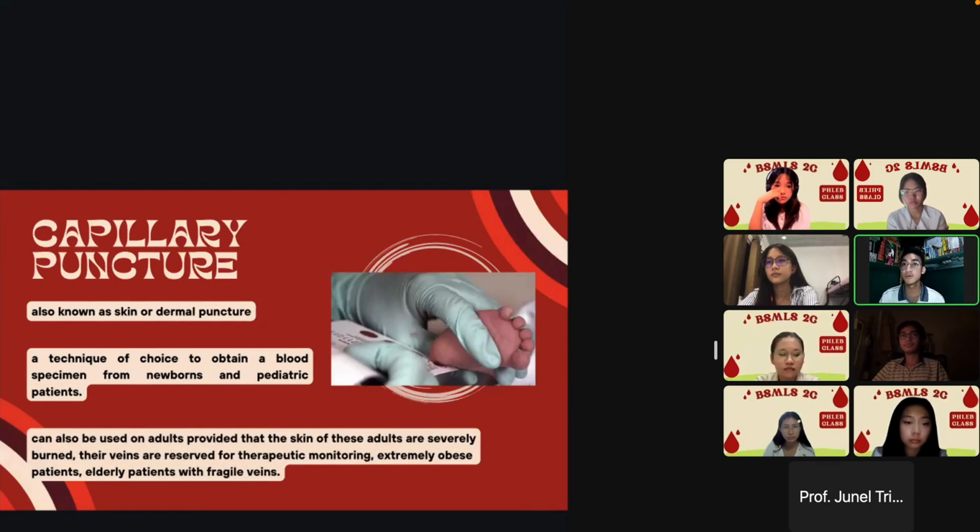Okay, I hope you have watched the video carefully so that you may use it in the course of our discussion. So, first, let us define what is capillary puncture.